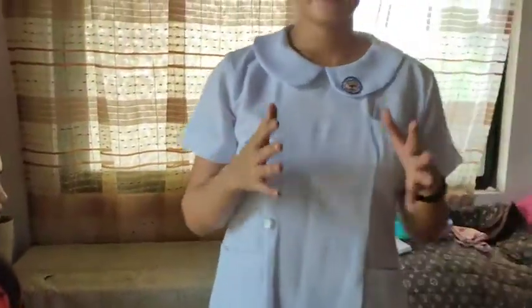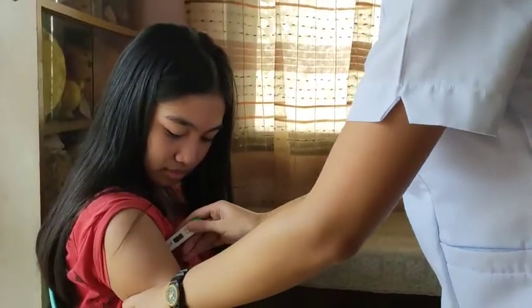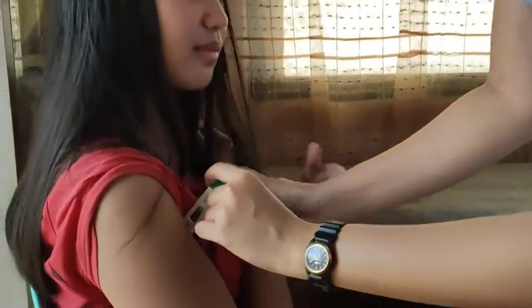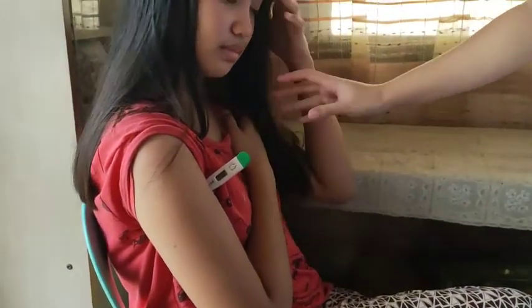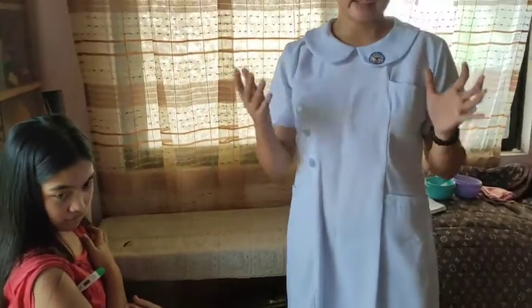We set it aside, then place the thermometer on the hollow axilla of the patient horizontally. Then we keep the patient's arm across the chest. This helps hold the thermometer in place so it will not fall down. After that, we leave the thermometer until the sound is heard.